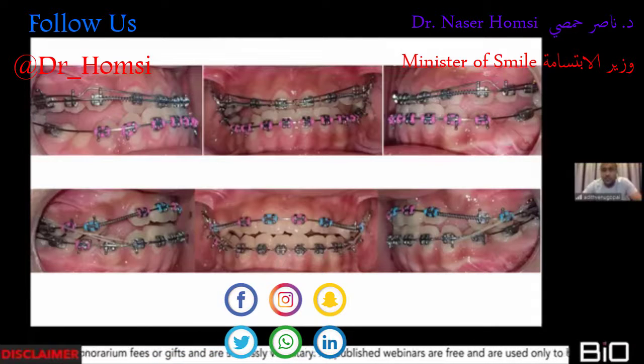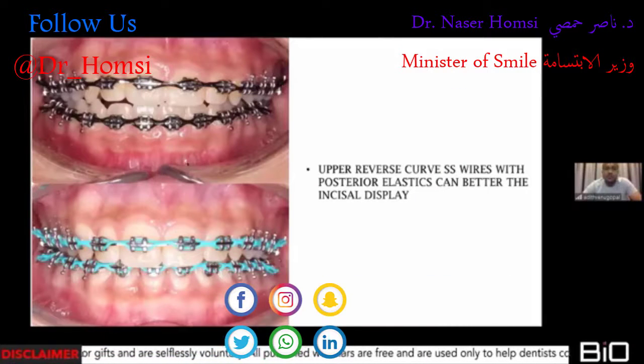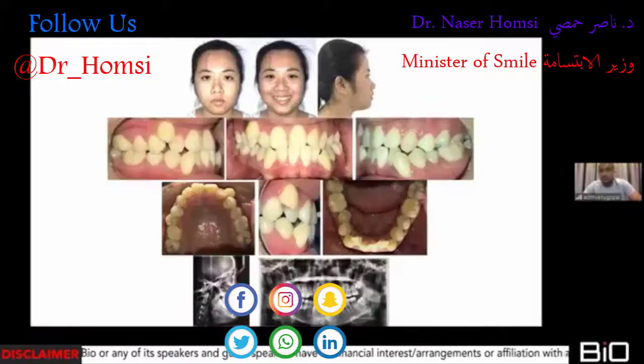So my solution to this problem is the use of reverse curve niti on the upper. I usually start using reverse curve niti on the upper in order to extrude the incisors back down and gain overjet. And there is a possibility that you might create a posterior open bite with the use of the elastics with the reverse curve. But you could use box elastics in order to curb that issue.